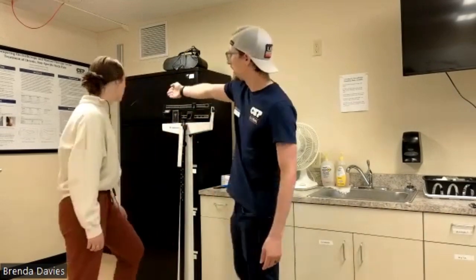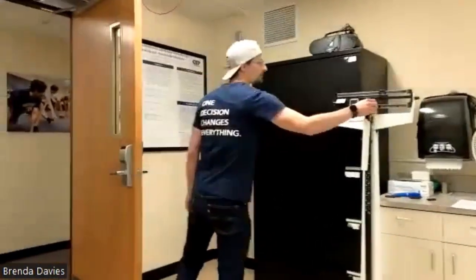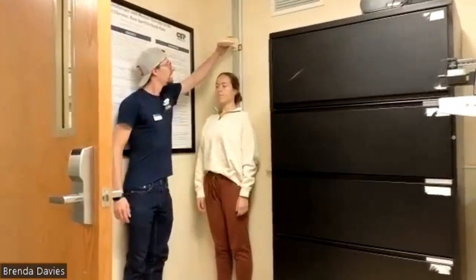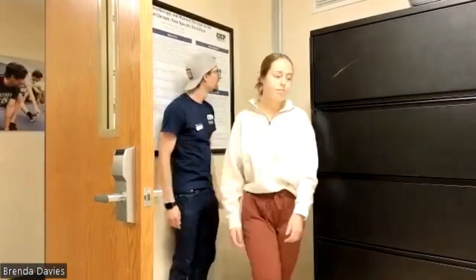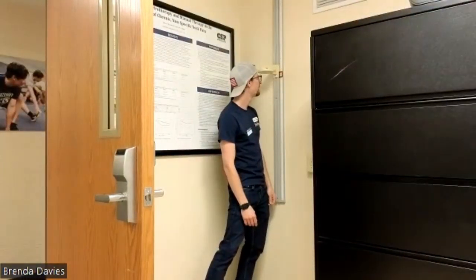Then you can go ahead and step with your back up against the wall to the stadiometer. Okay, take a deep breath in and look straight ahead. Okay, you can go ahead. All right, so we've got Anna at 5'6.5". Does that sound about right? Yeah. Awesome.